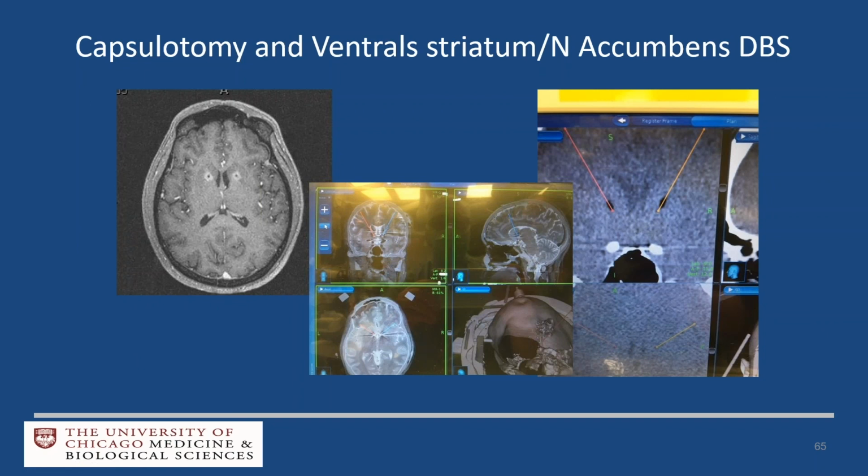We, as you might know, are the OCD FDA reference center. So we see a lot of OCD patients who either get treated with striatal DBS, covering the shell of the nucleus accumbens and the stria terminalis, or with an anterior capsulotomy, which we actually do with interstitial laser now. And again, you can see that your DBS electrodes, or in this case, the laser fibers on the right upper panel, are exactly where you calculated them to be with a superimposed trajectory.